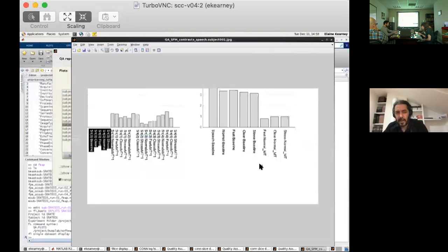This is telling you the t-value that you would expect to see if the signal-to-noise ratio was 1. So basically, if the size of the fluctuations that you expect to see in the BOLD signal is of the same order as the size of the residual fluctuations in the BOLD signal not accounted for by your model, that's a signal-to-noise ratio of 1, and then you would get a t-value of approximately 1 for those contrasts. So it's telling you, for a given size of the effects that you are looking at, what is the expected power or sensitivity of your data. So yeah, 1 is kind of borderline. Then you are only going to be able to see something if it sticks out from the noise. These subtle effects might not be as visible.